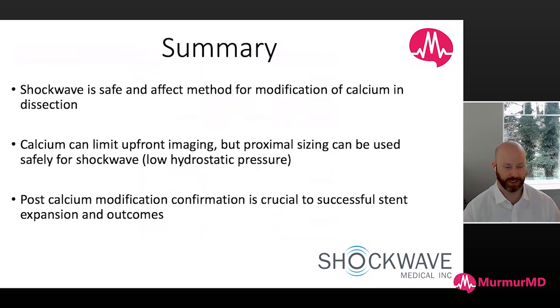Post-calcium modification confirmation is crucial to successful stent expansion and outcomes, and so we always recommend that after you perform lithotripsy or any other calcium modifying technique, you confirm that you have adequately treated the calcium so your stent can have the best outcome.